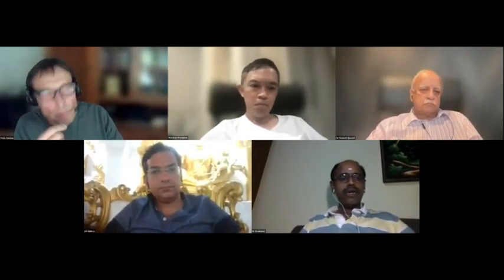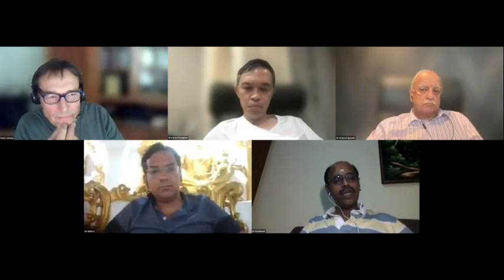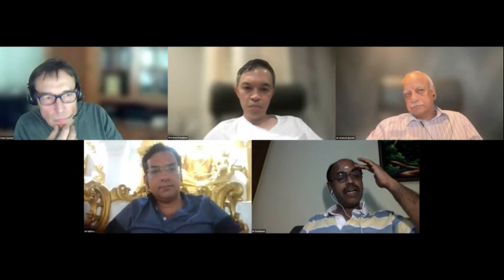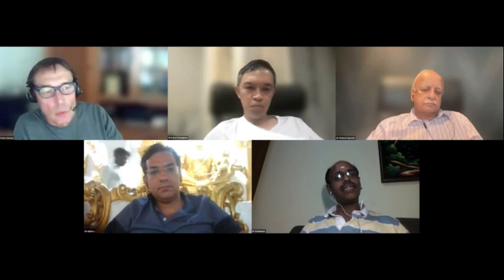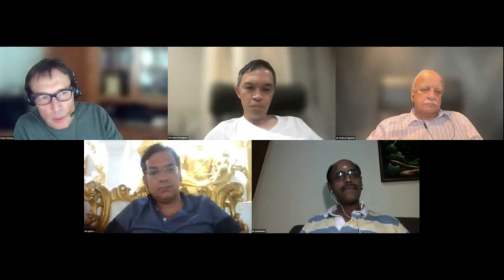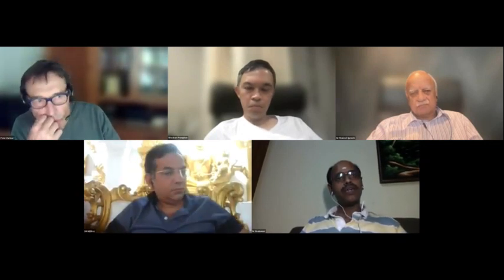Thank you. Peter, I enjoyed your talk, and it was nice to know that you have gone down to a weight of 600 grams. I assume it was a carotid access. Did you use a sheath, or you just had a small cut down and you advanced the wire and the stent directly? We went directly through the skin with a pre-mounted stent, and without using a sheath. So it was a percutaneous carotid puncture, not a cut down.